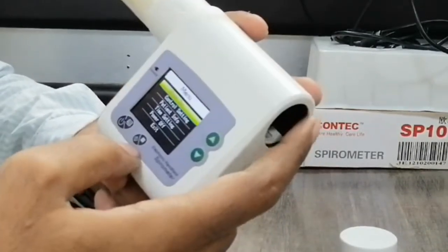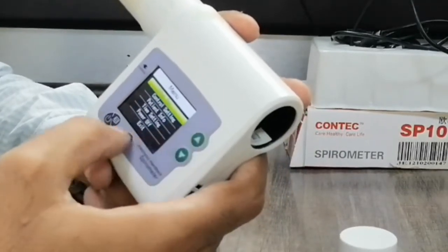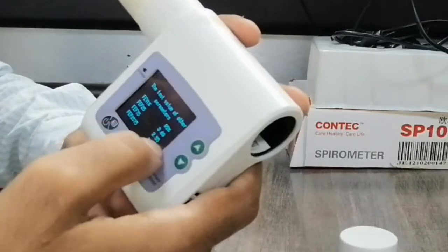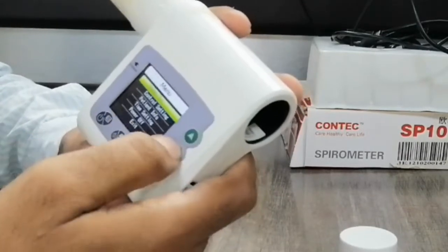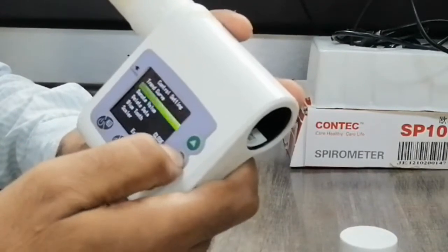In the menu screen, you can select different settings and view other parameters. These are all of the available parameters, and you can select or go back. The controls allow you to connect and configure parameters according to your requirement.